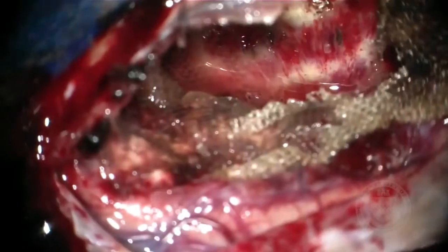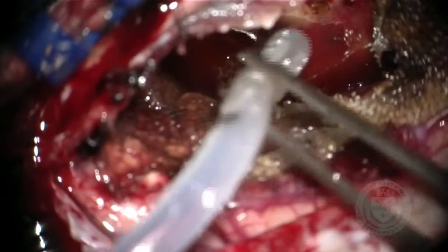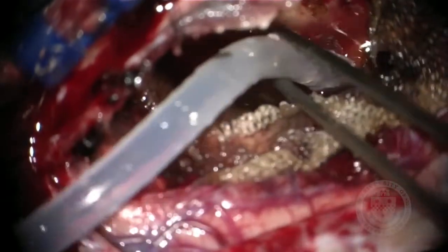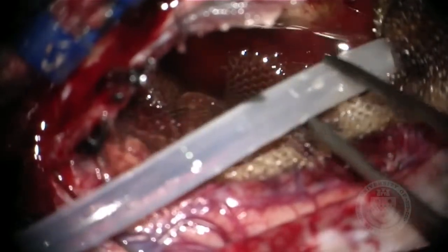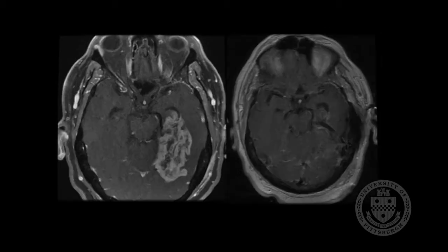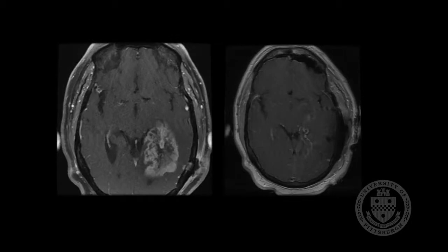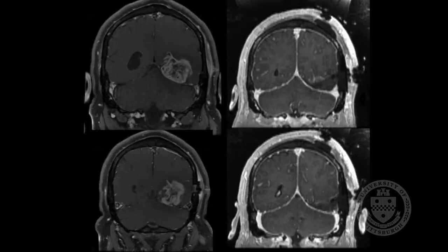At the end of the resection we can see the tentorium — this is a near total resection of this tumor. The ventricle is completely open, so we place a drain to prevent post-operative collection of blood inside the ventricles. Here you can see the post-operative view with a near total resection of this tumor, with good preservation of the surrounding normal brain.